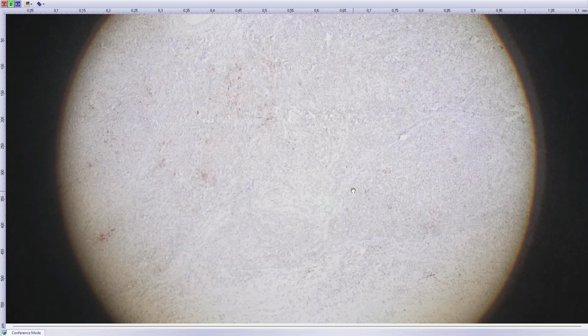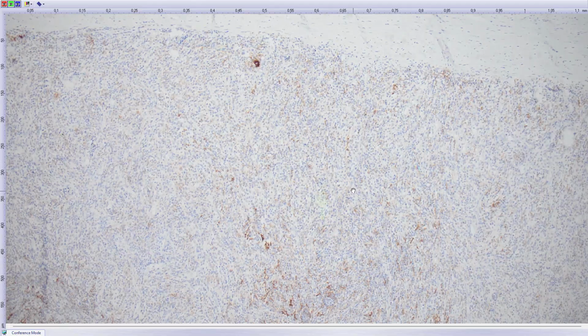The presentation is very good: a very sharply circumscribed, large tumor in the retroperitoneum. So I called it follicular dendritic cell sarcoma. One useful thing, even for diagnosis, but mainly for the patient, is that these tumors are typically positive for PDL1. So I also did PDL1 mainly for predictive purposes, but it also helped me to further establish the diagnosis. So this is PDL1.